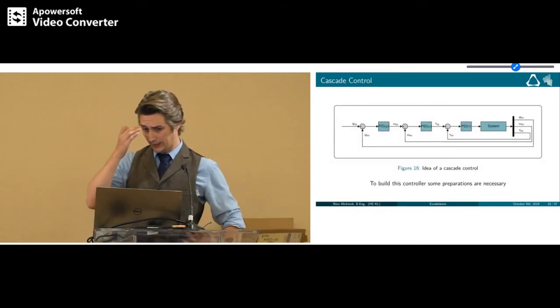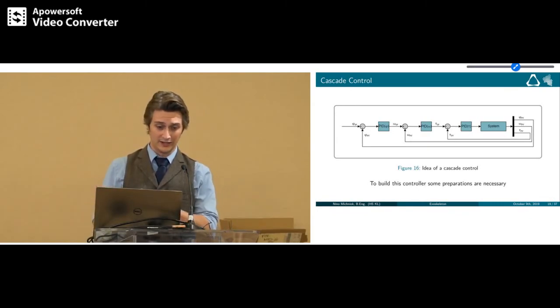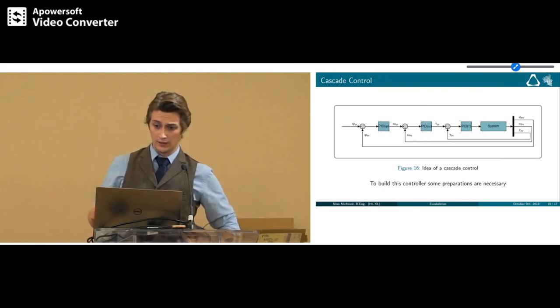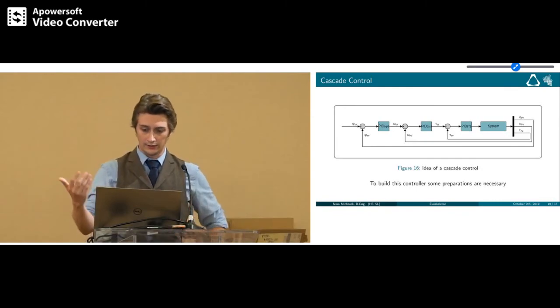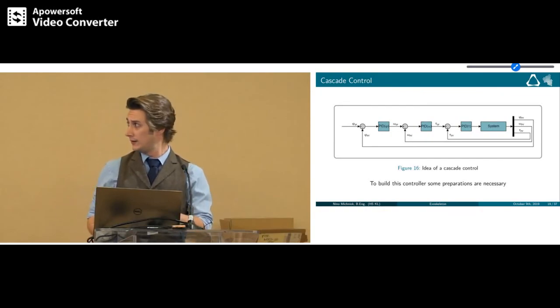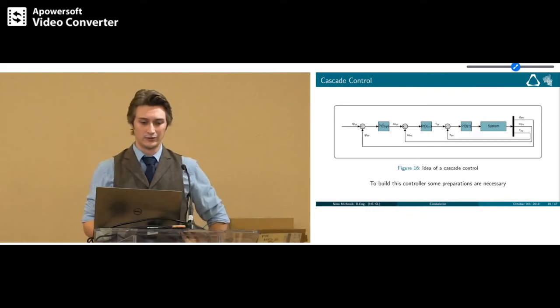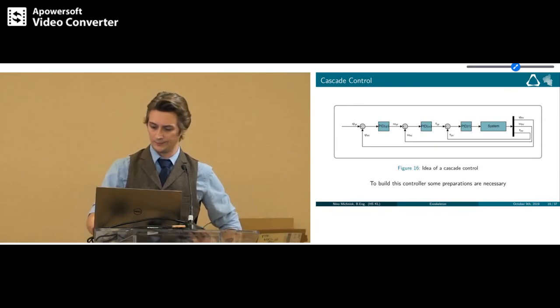So the idea can be seen here. I've decided to use all the information I could get, like angle displacement and angular velocity, to then get the torque as an input to my multibody system. This would be the controller for one joint, but to build this controller I had to do some preparations. This can be seen here. I had to do some replanning of the task, I will get to that in a minute. I had to then redefine the set points for the controllers. Could then do the actual controller designing, like parameter setting of the PID controllers, to then perform the co-simulation.